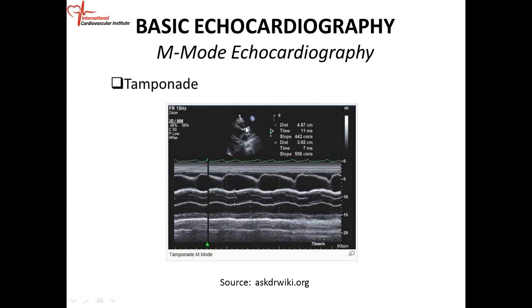Then you come to the aorta. One wall of the aorta, second wall of the aorta. Inside the aorta, you have the aortic valve: thin structures, parallel, closure line in the center, opens in systole, closing in diastole. This is another portion of the aortic wall. Then the left atrium is down here, your left atrial wall. The important thing is to see there's a periodic downshift in the RV wall.